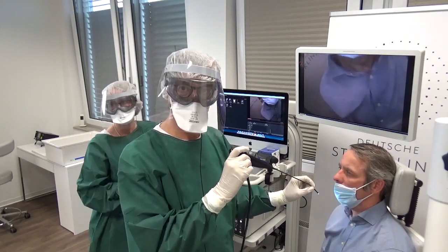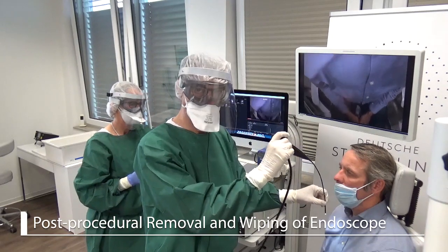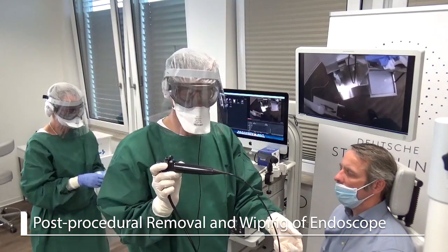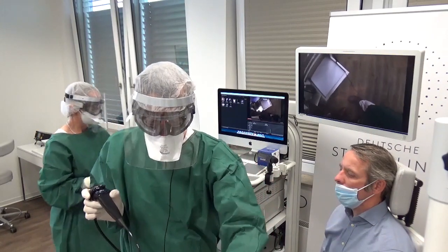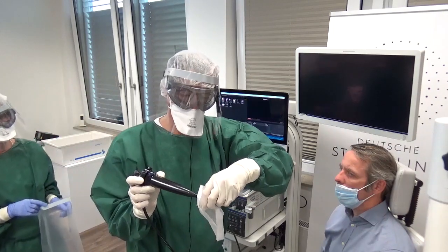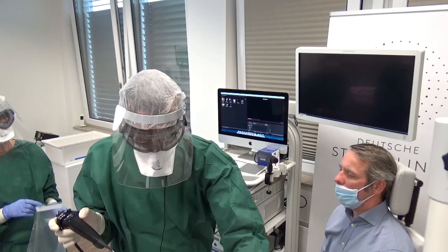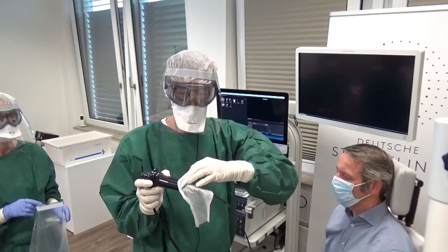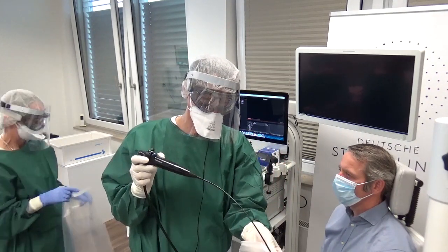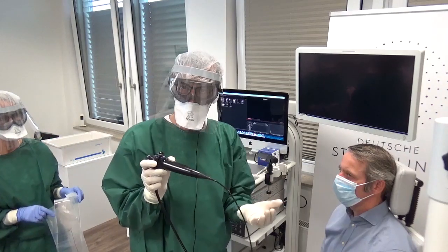I will not show how to do the procedure because from now on this is a normal, regular endoscopy. After I take the endoscope out after the procedure, I have a situation where this part here is covered with secretions. Then I take the endoscope with my contaminated left hand and clean it very softly and gently. I throw the first wipe away and take a second one, going over the end piece again including the tip. This is not the whole cleaning procedure, but this is the gross decontamination.